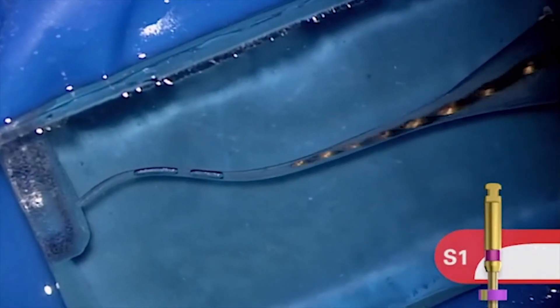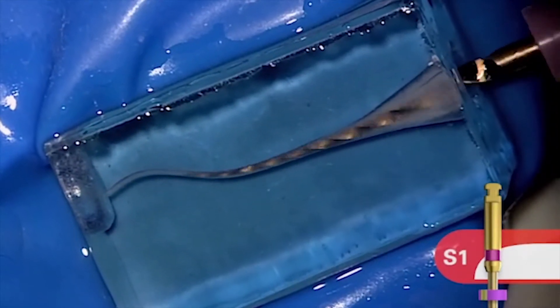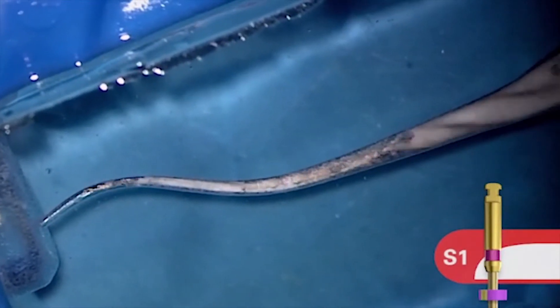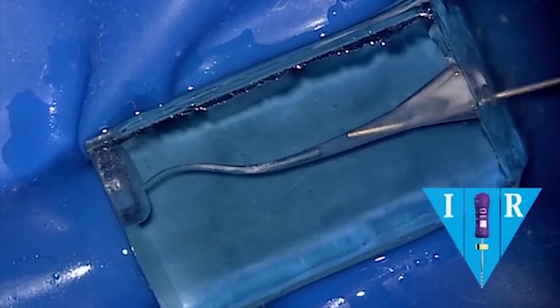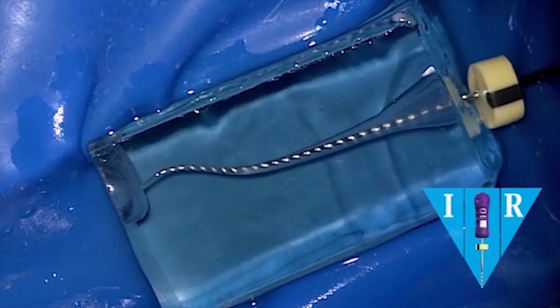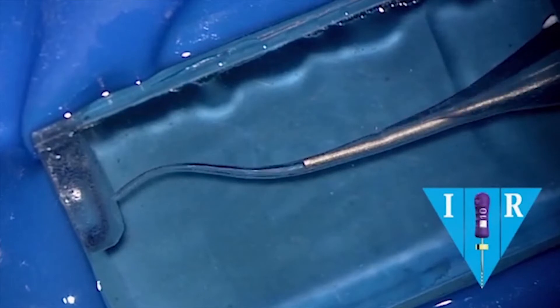Here comes S1. You don't have to know much about its geometries — it's purple. We know around the world the isocolor sequence to follow is purple, white, yellow, red, and so on. Notice I'm brushing. This canal is being pre-enlarged dominantly in its coronal one-third. Notice where the file is loading up — the tip of S1 is just following the glide path that was created by the 10 file and the ProGlider. Once we've achieved length, we can remove the file and again irrigate. A lot of colleagues skip these little steps and that's how we get into trouble. We can recapitulate with either the 10 file or even use a much more flexible ProGlider to just clear the canal, break up debris, move it into solution so that we can re-irrigate. Irrigate, vacuum, irrigate, vacuum.